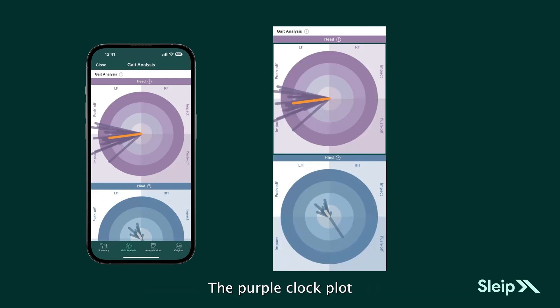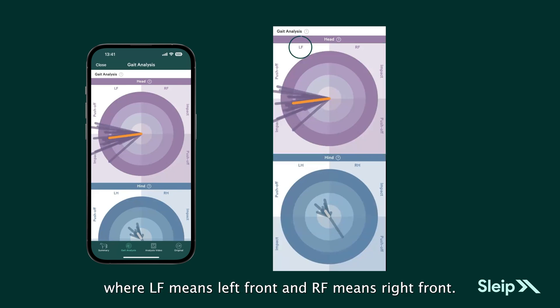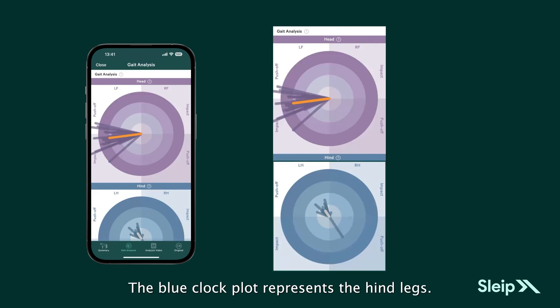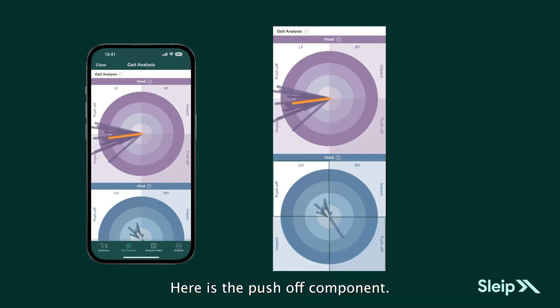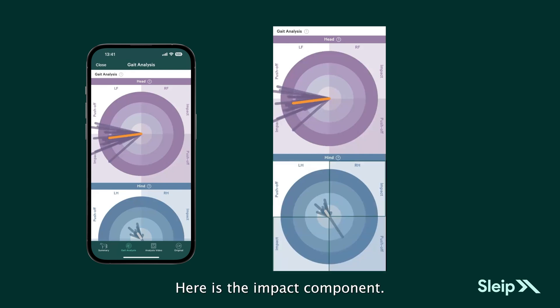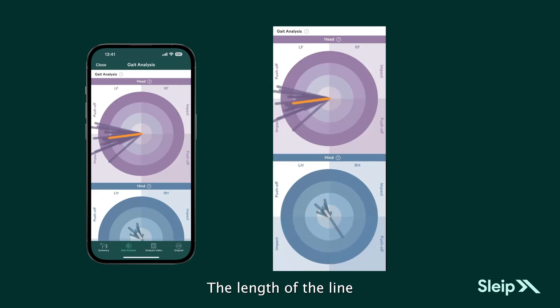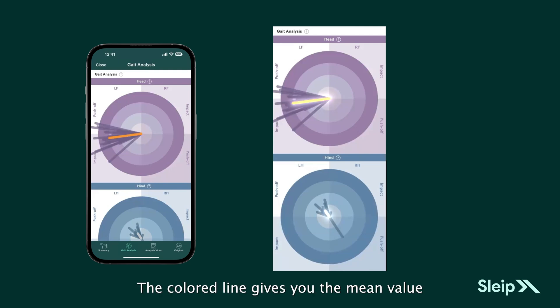The purple clock plot shows measurements of the head, where LF means left front and RF means right front. The blue clock plot represents the hind legs. Here is the push-off component and here is the impact component. Each stride is represented as a line, and the length of the line indicates the severity of the asymmetry. The colored line gives you the mean value of all strides included in your analysis.